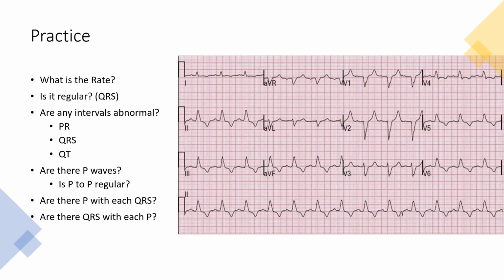Here's another practice. Look at this ECG. Use our rhythm and rate methodology to assess for abnormalities, and then we'll try to synthesize if there's any reason why this is occurring. Pause now, and when you restart, I'll go over the answers.